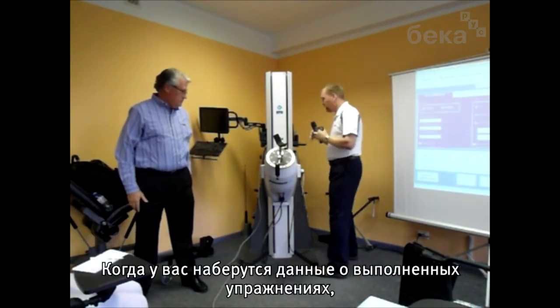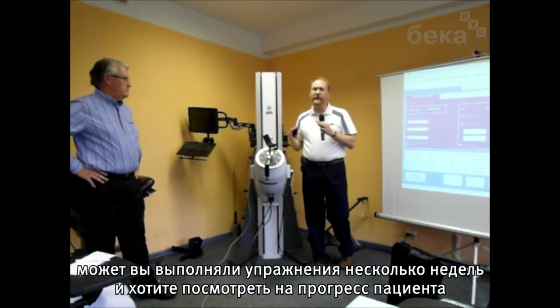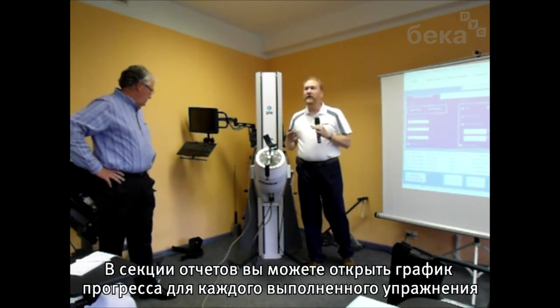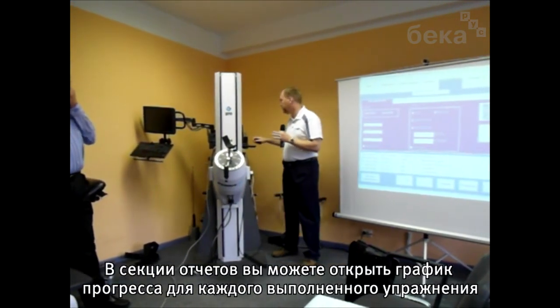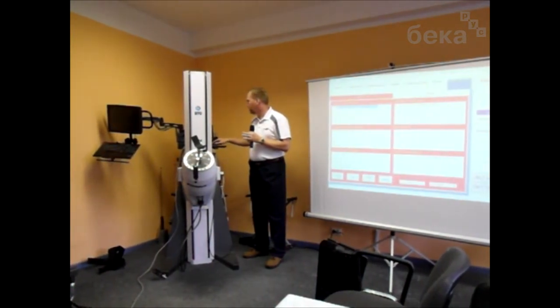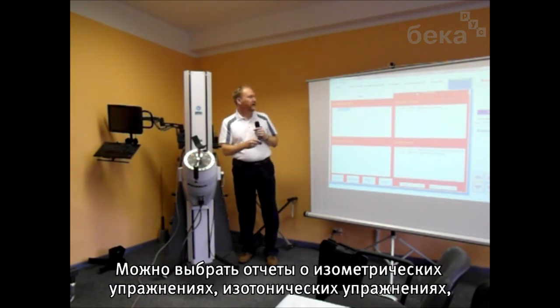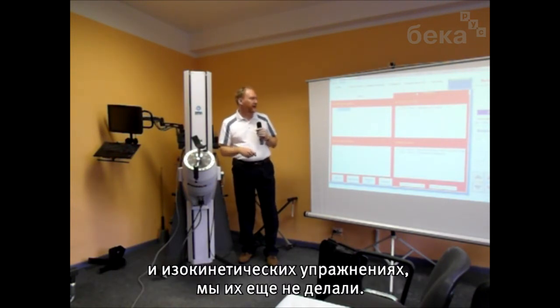So once you've collected your exercise data, maybe you've done this for a couple weeks and you want to see what kind of progress that person's doing overall. In the report section, you can retrieve a progress graph for each of the exercises you have on that person's routine. Treatment options. And it shows you a field for the isometric exercise, for the isotonic exercise, for CPM, and isokinetic, if you've done any of those.